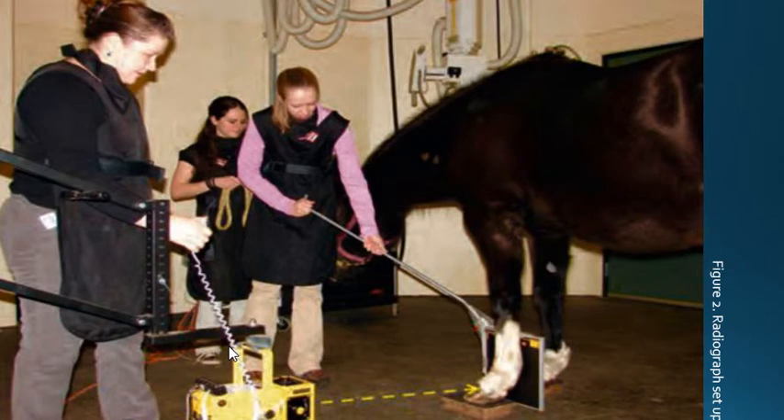The horse's legs should be squared and perpendicular to the ground. The person holding the cassette should be cranial and lateral to the horse's legs, holding the cassette holder at a 45-degree angle so that the cassette is perpendicular to the ground and parallel to the horse's legs.